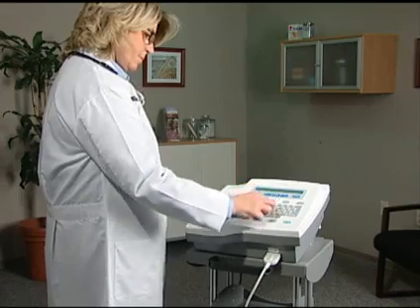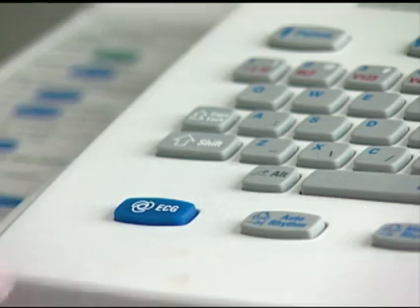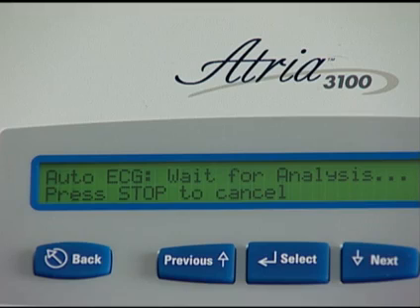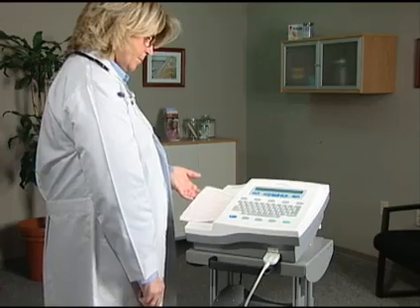Once you've entered all of the demographic information, press Home. Press ECG. Then press Select and choose ECG on existing patient. Your ECG report will then print.